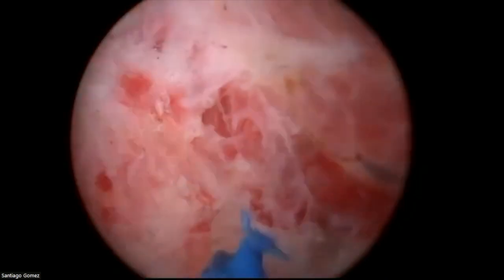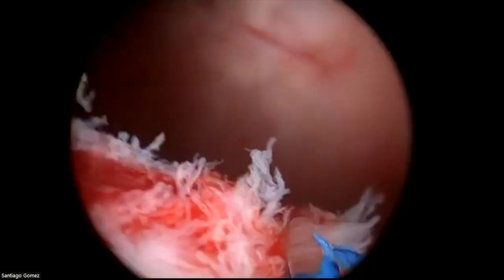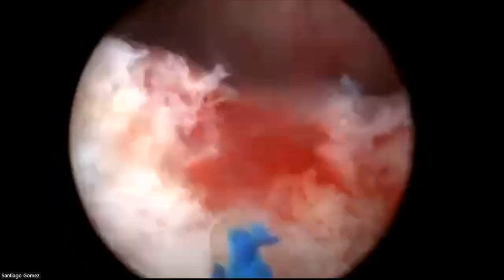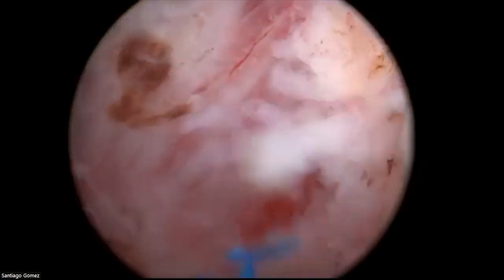And more than the fossa, which is important, of course, I would check the mucosa here. You see, we discussed that this laser has an explosive effect. And it's very good to dissect the plane, but it's not so good as a cutting tool. So here, instead of doing a clean cut and coagulating the edges, it disrupts the mucosa. And often you have to spend the last minutes of the coagulation phase paying attention to the mucosa, because it tends to bleed. And here is where you can find the trouble later on when you do your morcellation. If you're not careful doing this final hemostasis, then you can have trouble.